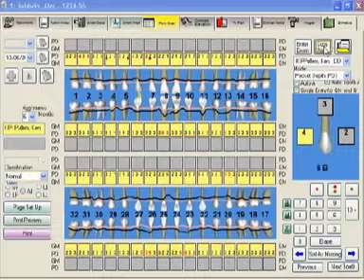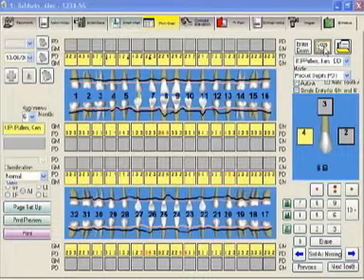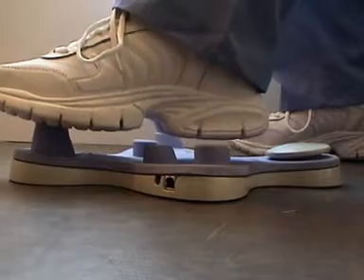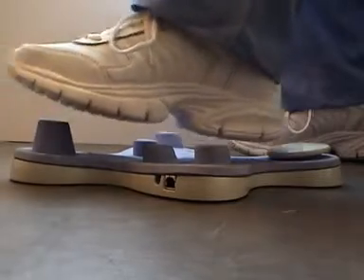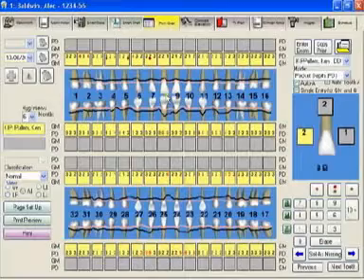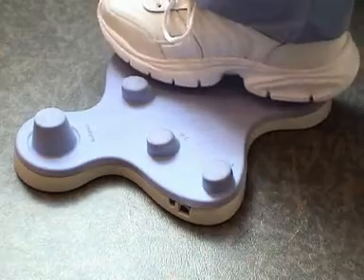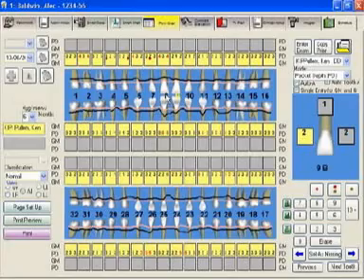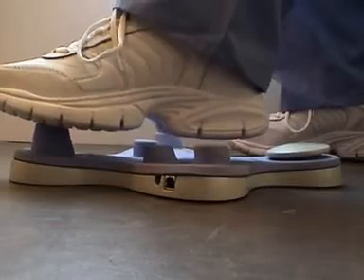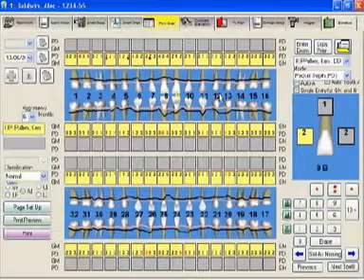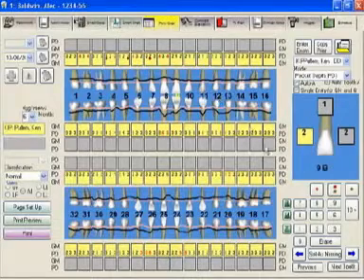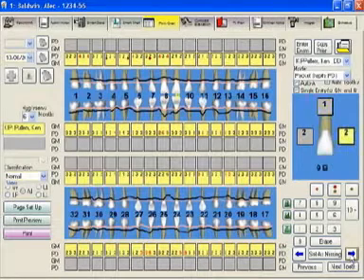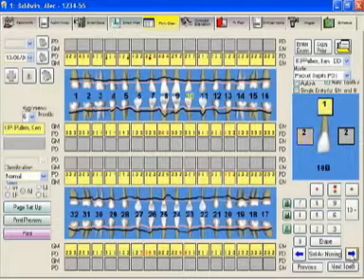Let's just say all the pockets have stayed the same on two through seven and number eight has changed. So what you're going to do is you're going to mouse over to number eight and you're going to heel click. And then maybe number eight is now a four, three, four. So you're just going to enter with your dental rat the four, three, four. And you can take your mouse either on the forward button or to the next tooth that does change. So you're still probing, checking everything and either setting your mouse down here on the forward button and letting it auto advance till you have a tooth that changes or you can just mouse directly to the tooth that you want to change.